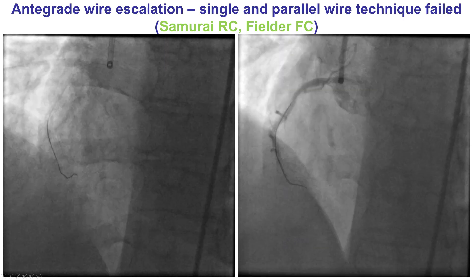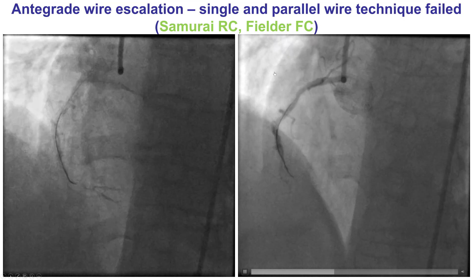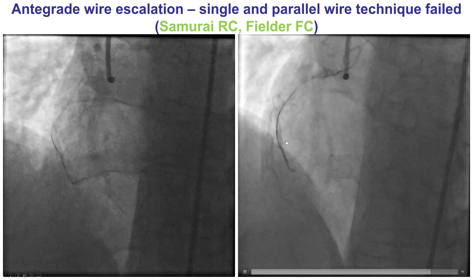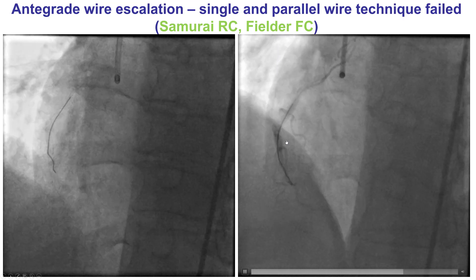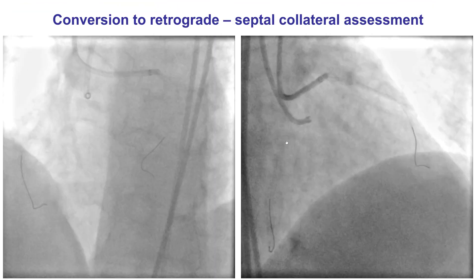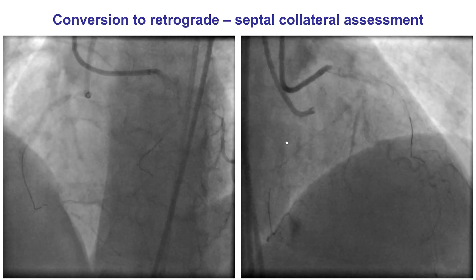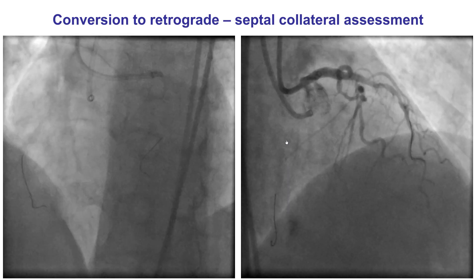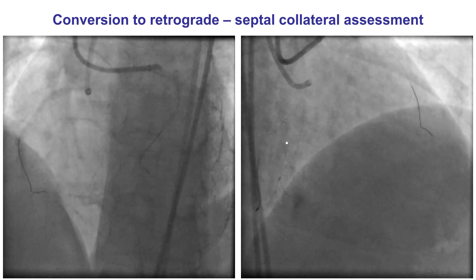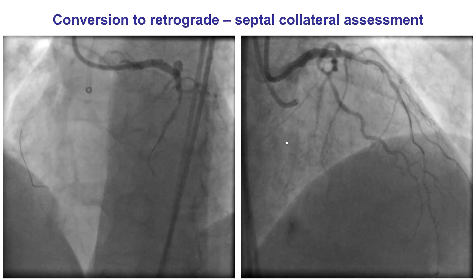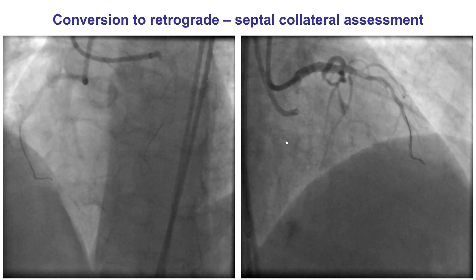We then tried a Fildер FC polymer wire and unfortunately this caused acute closure of the distal right coronary artery. This is one of the examples where polymer wires may be more likely to dissect and cause acute vessel closure. Fortunately, the patient did have a very severe lesion to start with and remained stable without angina and without any hemodynamic compromise despite occlusion of the distal right coronary artery. However, we were still unable to advance an antegrade wire through that area of dissection.